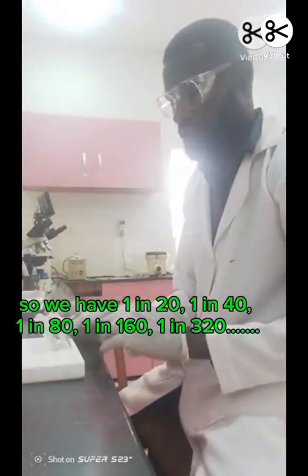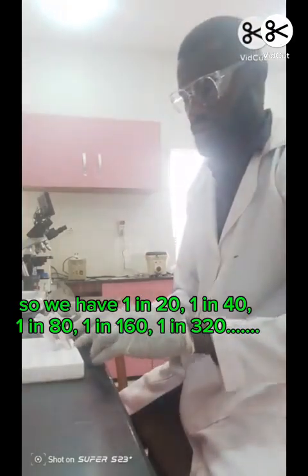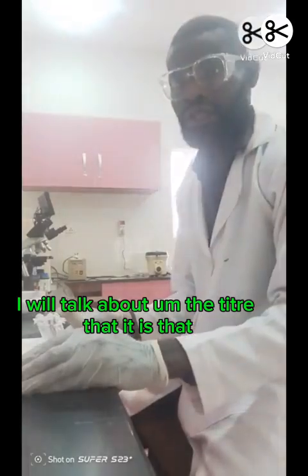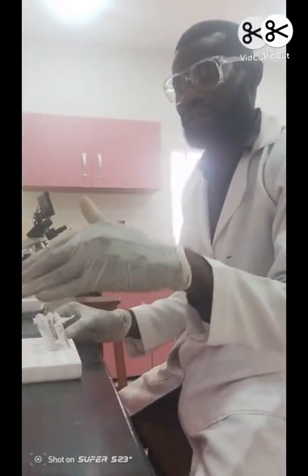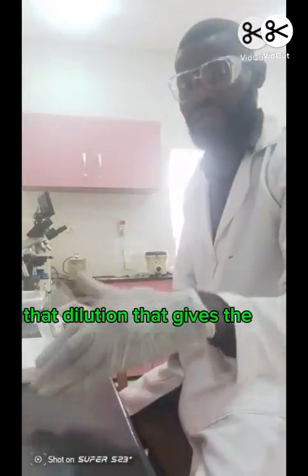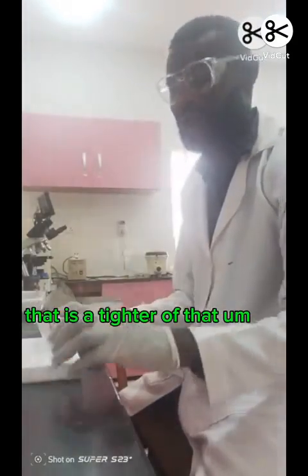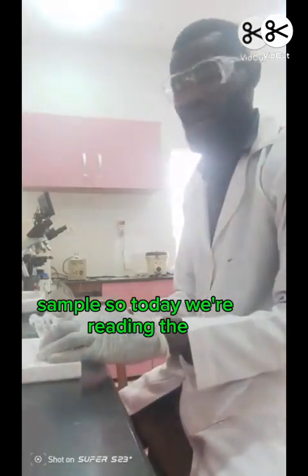So we have 1 in 20, 1 in 40, 1 in 80, 1 in 160, 1 in 320, and so on. And we talked about the titer, that it is the dilution that gives the highest dilution with visible agglutination. That is the titer of that sample.